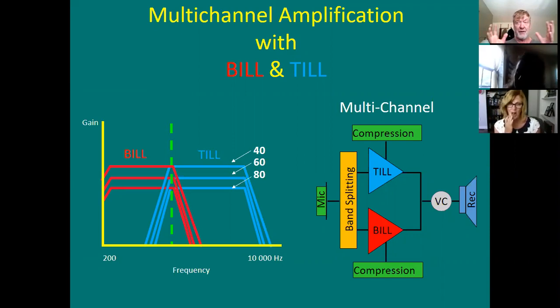Yeah, the world was really hyper. It was the early mid-90s, and people were thinking, boy, are hearing aids ever complicated. Wow, they're 2-channel. They've got Bill and Till. Bill and Till are basically just amplifiers then, because they're listed on your diagram as triangles. Yes, those hearing aids had 2 amps.